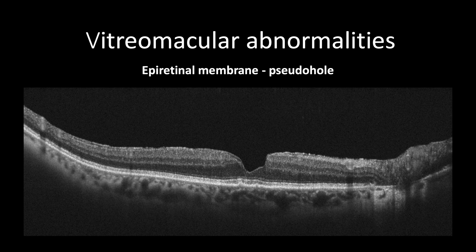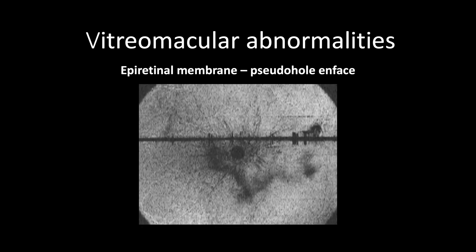In advanced cases of epiretinal membrane, a pseudo-hole may be formed, which appears as verticalization of the fovea, reshaping it in a U or V shape, with increased retinal thickness and overlying epiretinal membrane. One key feature of the pseudo-hole is that there is no lamellar defect in the outer retinal tissues; the ellipsoid zone and external limiting membrane are typically intact. One way to accurately diagnose a pseudo-hole is using en-face OCT, where the pseudo-hole will feature a circle surrounded by another smooth circle, with radial folds emanating and forming a sunflower pattern.